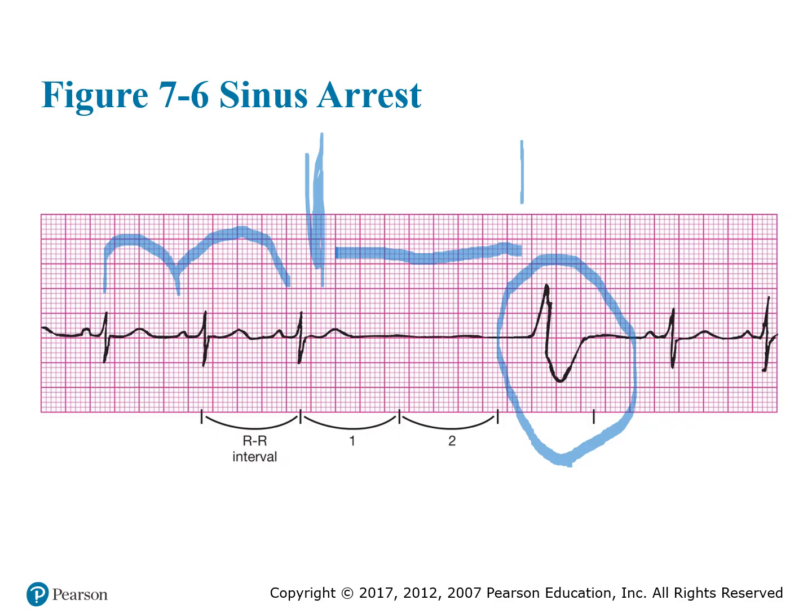So this backup beat kicks in to make the ventricles contract, right? There is no P wave here, which should have been right here. So this came from the bottom part of the heart, not the top portion, just the bottom portion contracts. The ventricles contract. It circulates a little blood, just to keep your body alive, to keep everything going, hoping that the heart will pick back up.